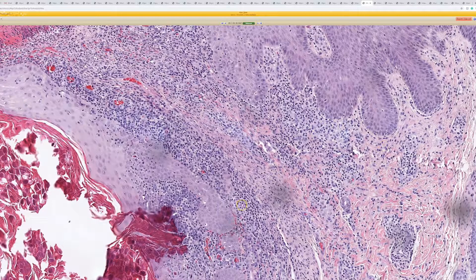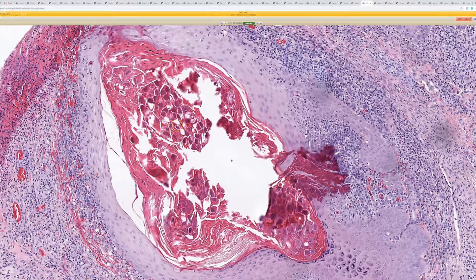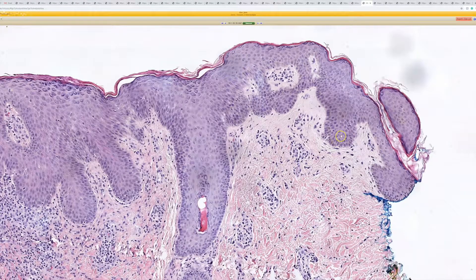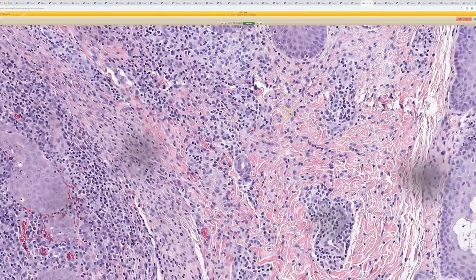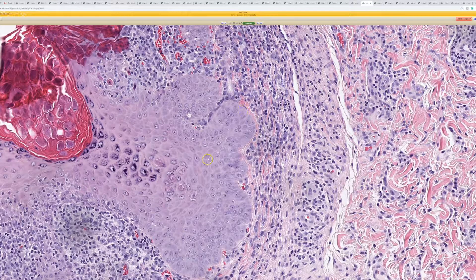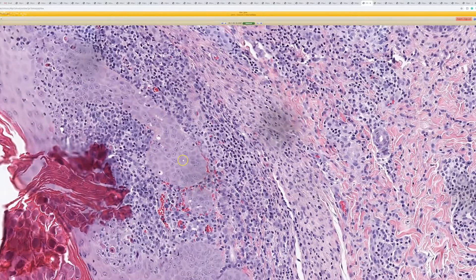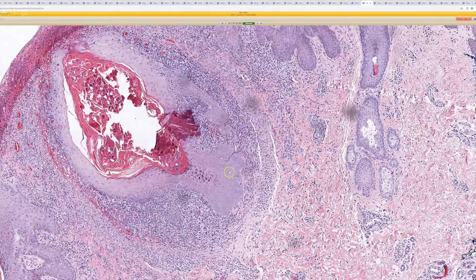The keratinocytes of molluscum — really important to note. When you see molluscum, you see those Henderson-Patterson bodies and you don't think about anything else. But look at the normal keratinocytes here — kind of small. Then look at the keratinocytes in the molluscum: they are big, puffy keratinocytes. I've seen cases where a funny cut didn't show the molluscum bodies, and people were actually worried about carcinoma. So if I see a little lobule of keratinocytes in the dermis with big, puffy-looking cells, sometimes I'll cut deeper and find the molluscum there.